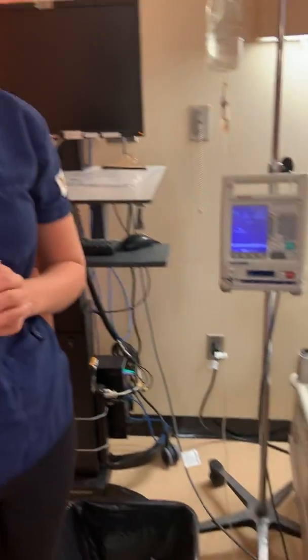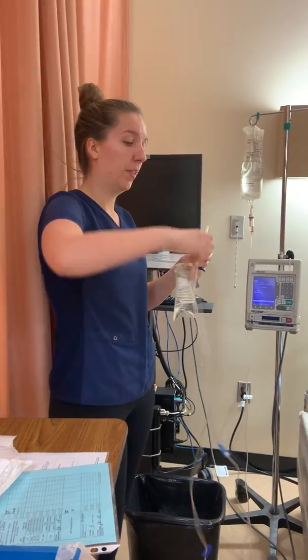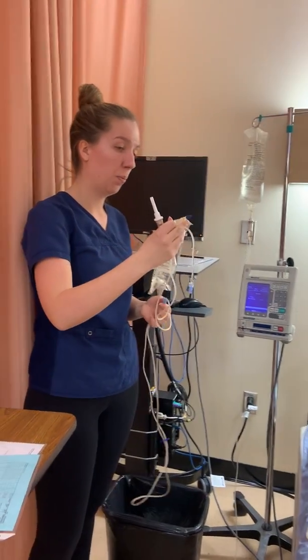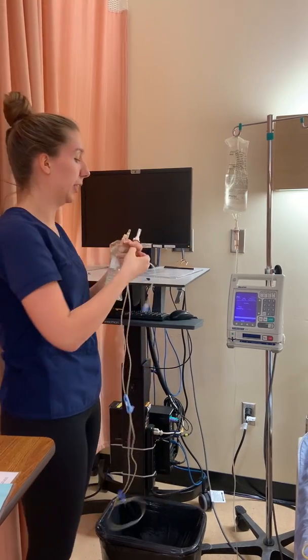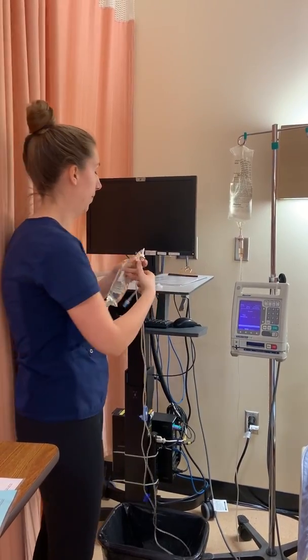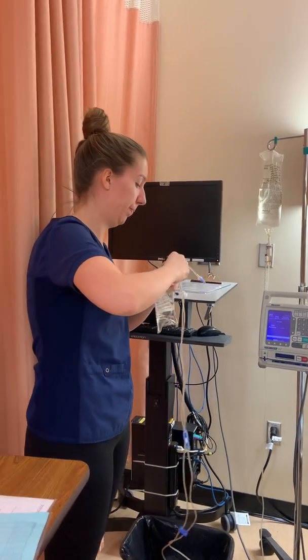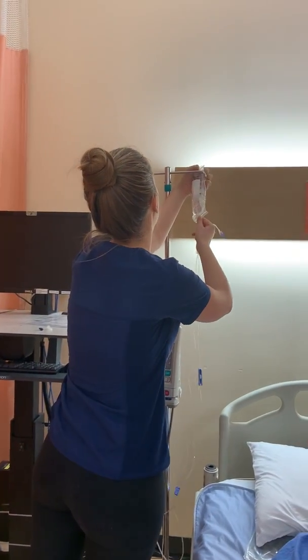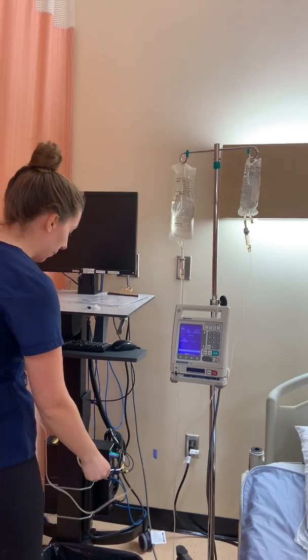So at this point, I'm going to prime my tubing. So I selected tubing without any ports. I'm now just going to put the clamp on. Take off the blue cap while maintaining sterility. And now attach it. So I've attached it, I can now hang it up. And I'm now going to unclamp it so I can prime my tubing.